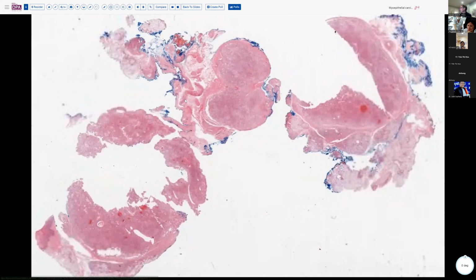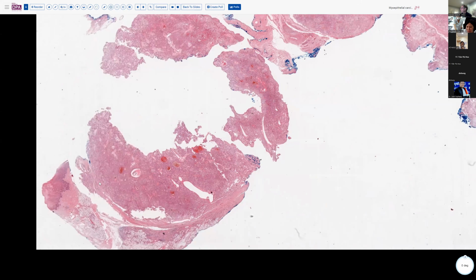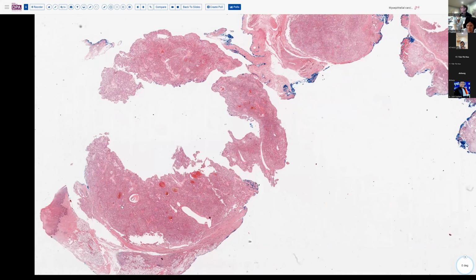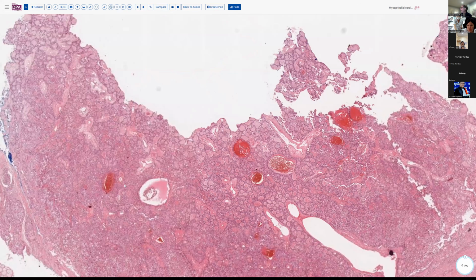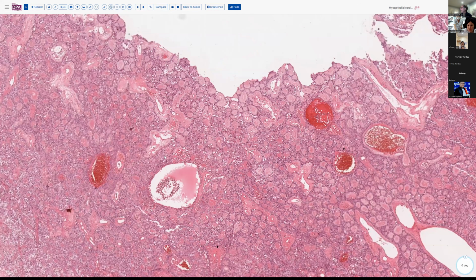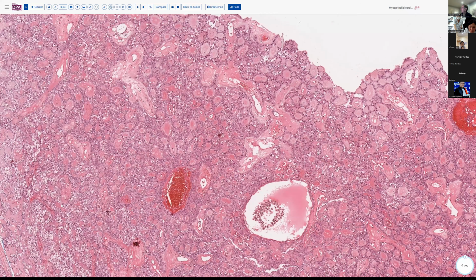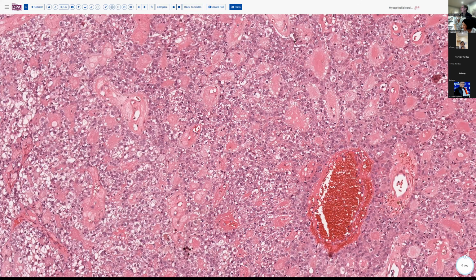So let's look at some examples of this and see if you can discern the differences. So here we have squamous mucosa, salivary gland tissue, and this tumor. We'll look at higher magnification here. You can see a little bit of this rounded and nesting pattern. I think you can also begin to see a little bit more atypia to some of these cells than we saw in that earlier pattern. Notice the clear cell pattern here, and there's a bit more nuclear variation.